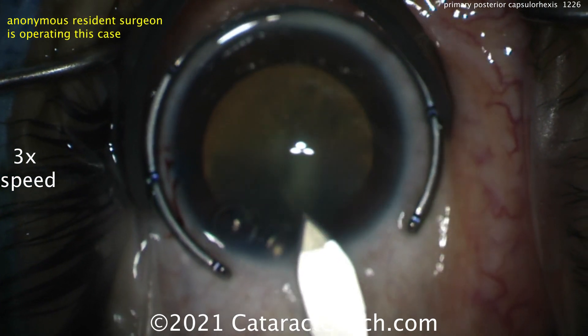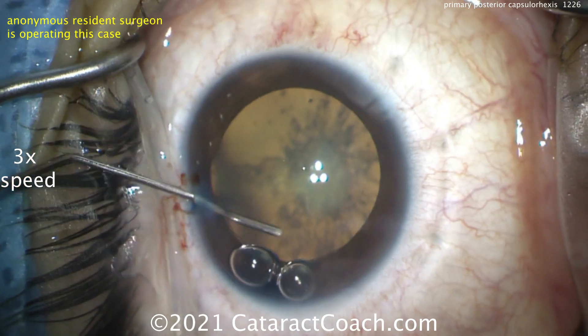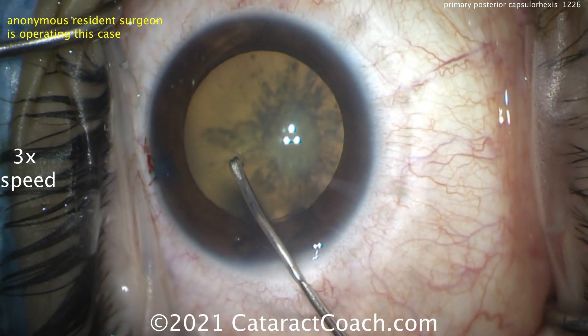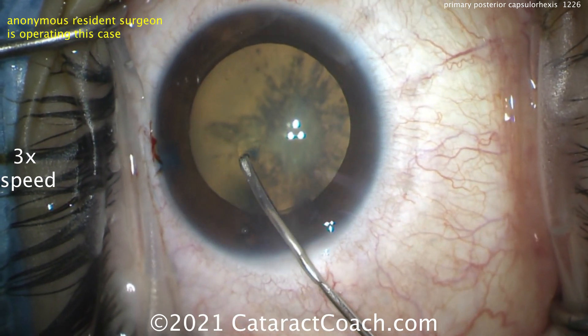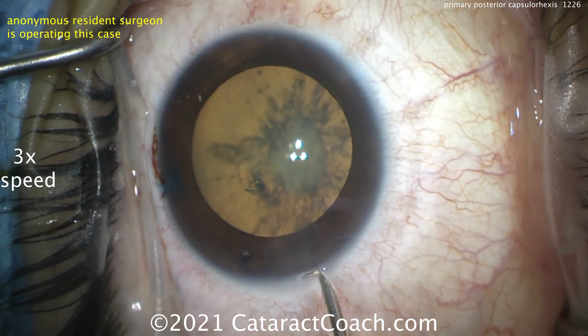You can see the cataract is very significant. The eye goes out of focus because the resident is pushing the globe into the orbit. Take out those bubbles — getting a nice capsule rexis here. You want about a 5-millimeter rexis, keeping in mind that the capsule may be more elastic than you think. The resident likes to start with a cystotome, which is fine.